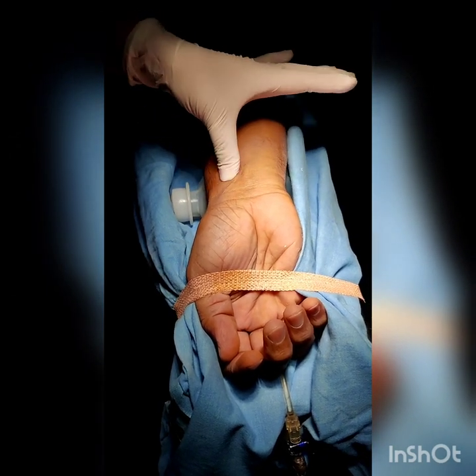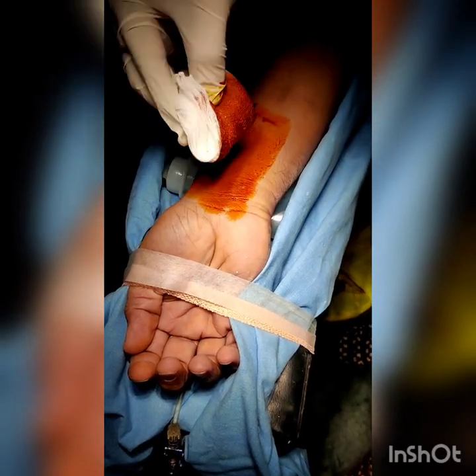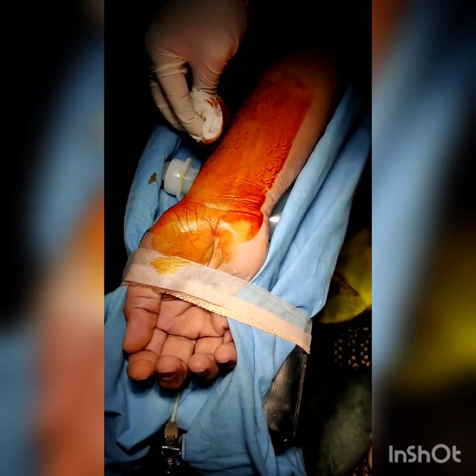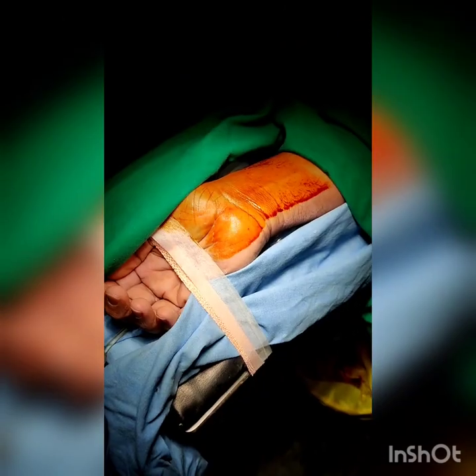Using all aseptic precautions — wearing a sterile gown and gloves after washing up or an alcoholic rinse — clean the surface with betadine for antisepsis. Place sterile drapes all around the puncture site.